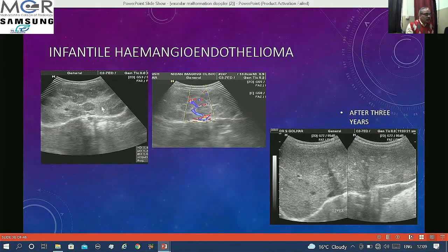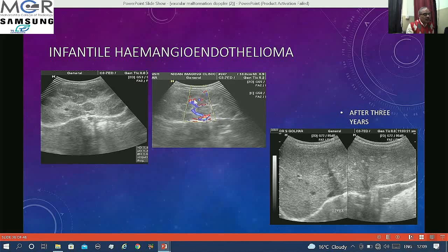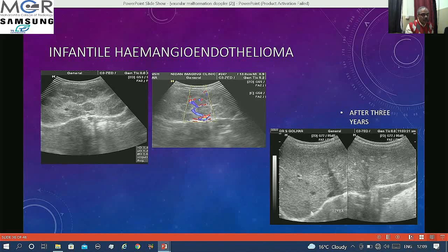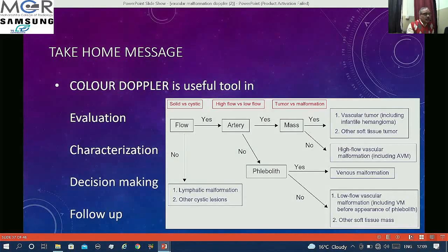Internal organ hemangiomas: a child had multiple hypoechoic lesions in the liver not picking up much color, while intervening tissue showed vascular supply. Biopsy confirmed hemangioendothelioma. Over the years they showed regression in size and gradually faded away. The patient was followed up for almost ten years and has now grown into an adult with a normal liver — demonstrating the natural history of involution.